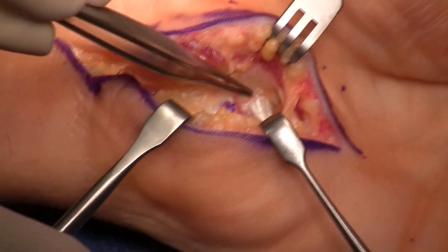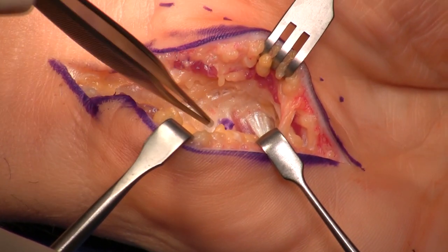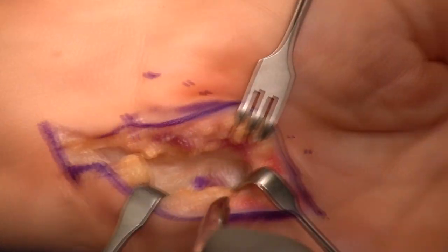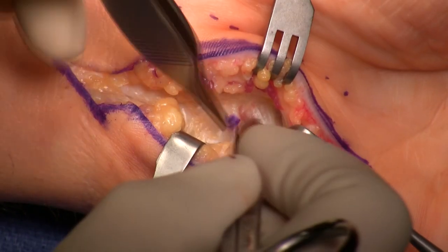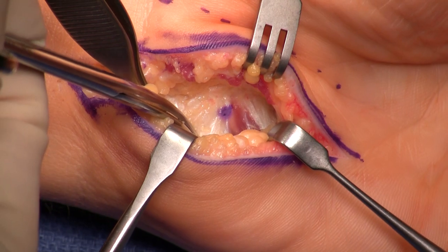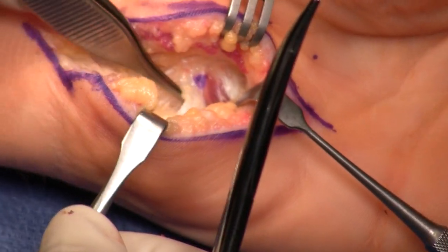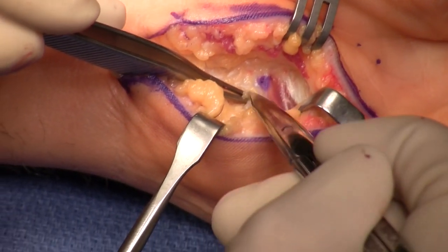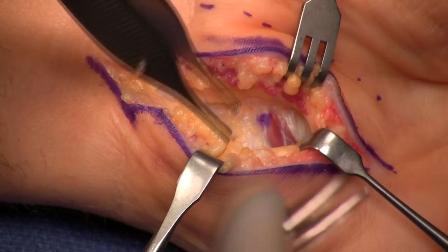After I feel the hook of the hamate, my next step is to look at the hypothenar muscles, especially to note where I don't see them anymore. This is a special trick here. So I move everything medially, and then I look at the muscle and fascia of the hypothenars. Where I no longer see them is where I'm going to find the deep motor branch. There's the hook, there's the fascia, there's the leading edge where I no longer see it.